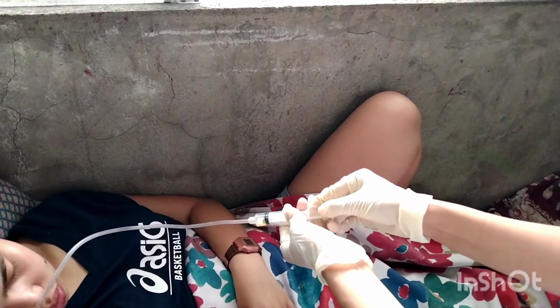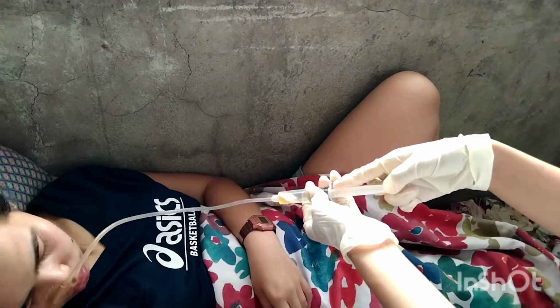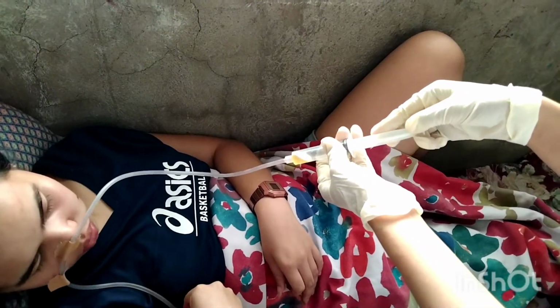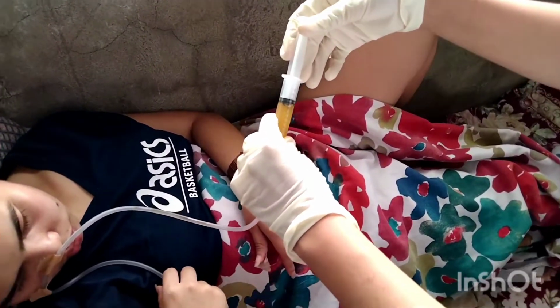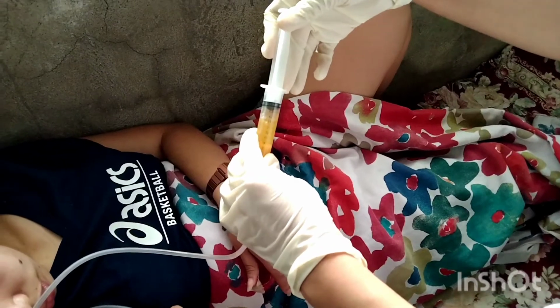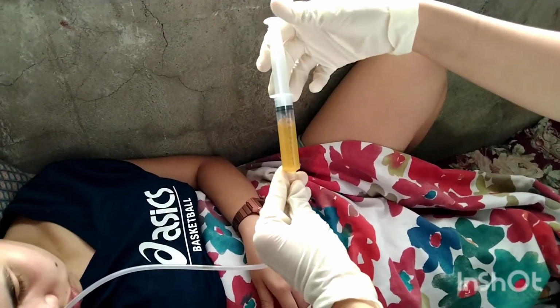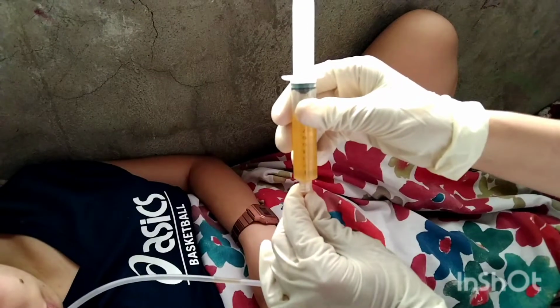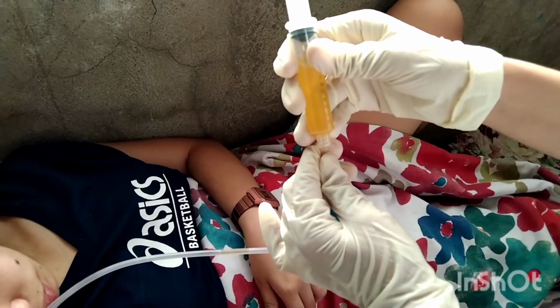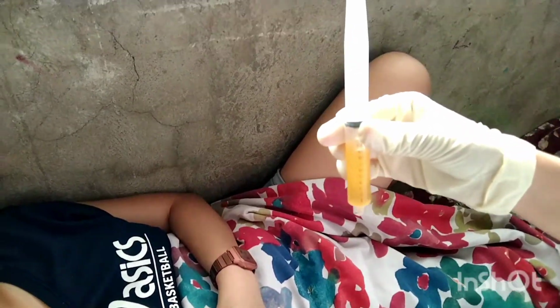Next is to determine tube placement. Aspirate gastric contents to check for gastric residual. Return aspirated contents to stomach unless the volume exceeds 150 ml. Presence of gastric secretions indicates that the distal end of the tube is in the stomach. Residual volume indicates if gastric emptying is delayed. Delayed gastric emptying may be reflected by 150 ml or more remaining in the client's stomach.